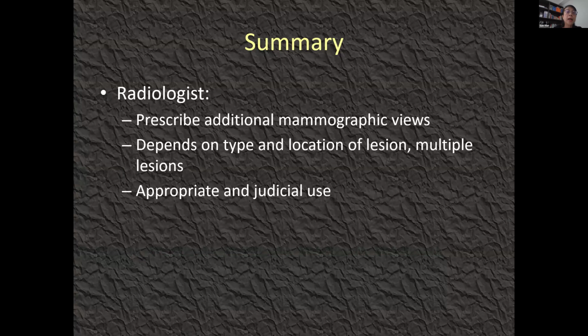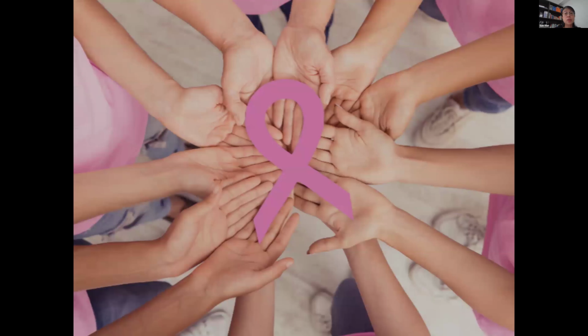The radiologist's role is to prescribe additional mammographic views, and this depends on the type and the location of the lesion in question, and if there are multiple lesions. And it is up to the radiologist to employ appropriate and judicious use of these mammographic views in order to answer the clinical question with the least amount of radiation possible. So it is important for all of us to play our part in the patient's breast imaging journey.